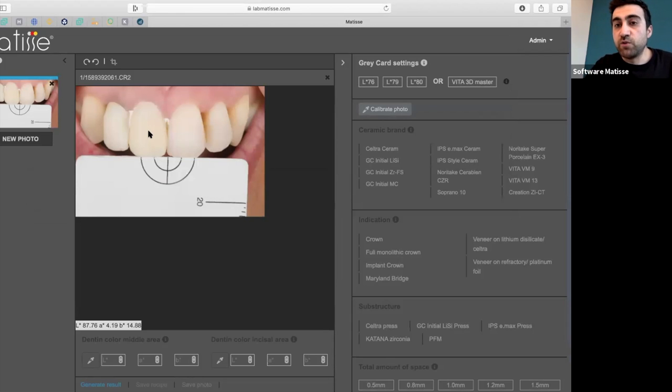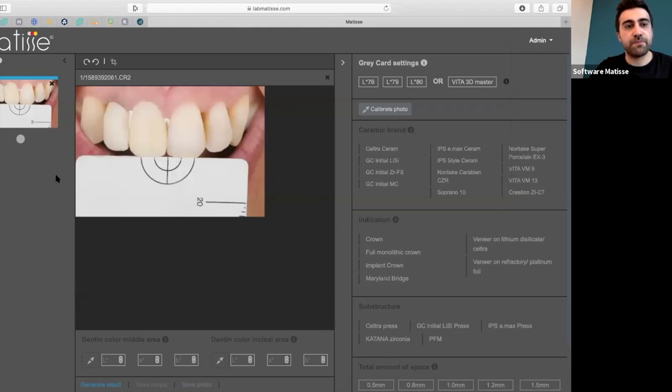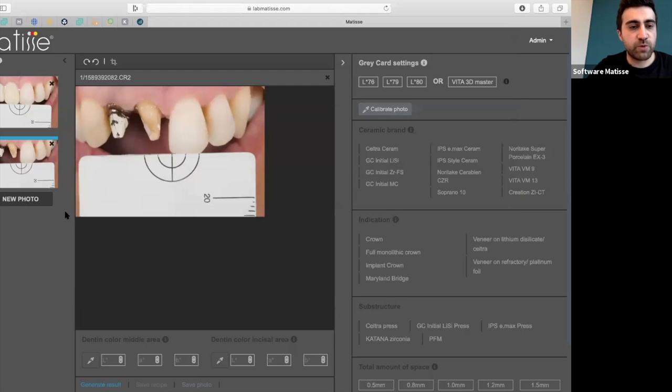The first thing that they do when the patient goes to the dentist. Second one is what the dentist photographs. It's not allowed to take a picture of the preparation after the treatment, because there will be dehydration. It is important that the preparation is wet, not dried out. And we also need a picture without the cross-polarization filter.